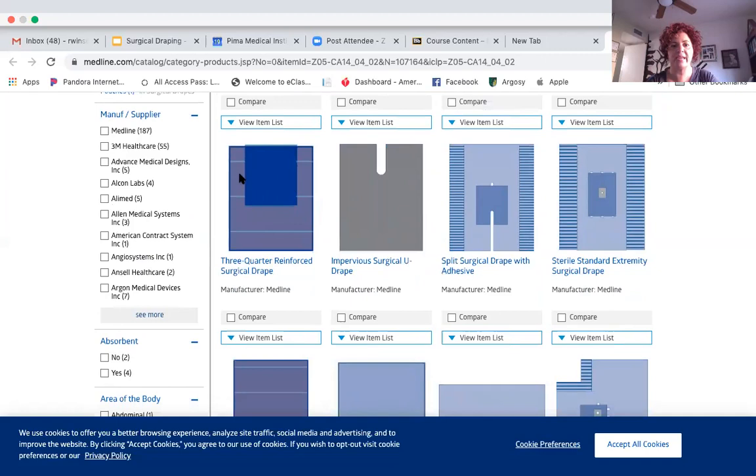Some of them have a reinforcement, like this reinforced area would go up closer to the patient's torso. There are directions when it's folded, it'll say reinforced end with arrows that way. You always want to put that end towards the patient's torso, so orient it. So you can see these cutout ones, good for going in between the legs, and kind of for a hip or shoulders, where we're kind of isolating a joint, a hip joint or shoulder joint.